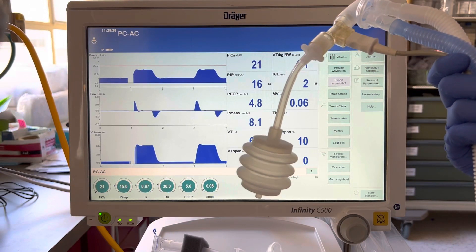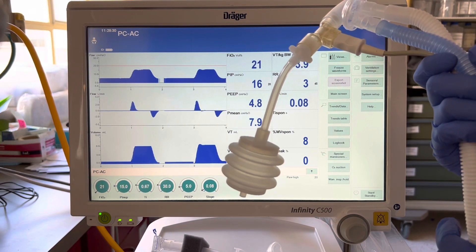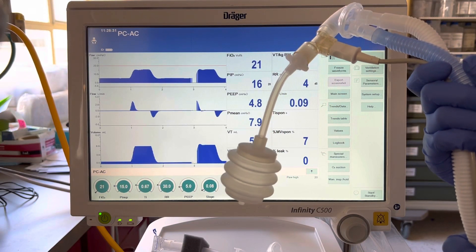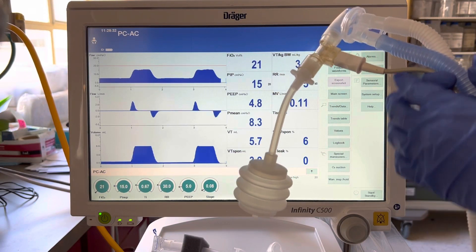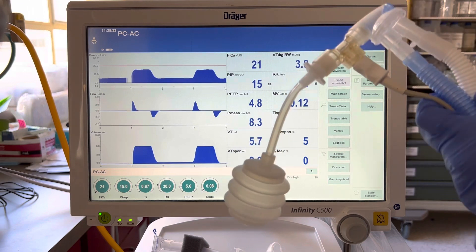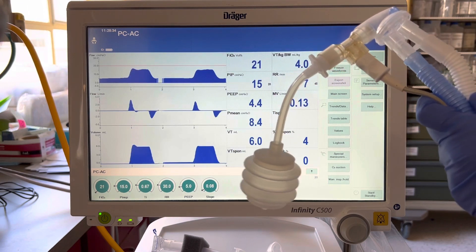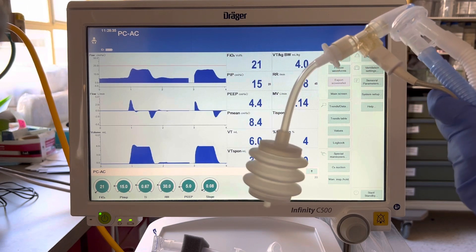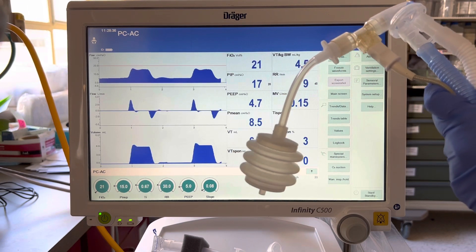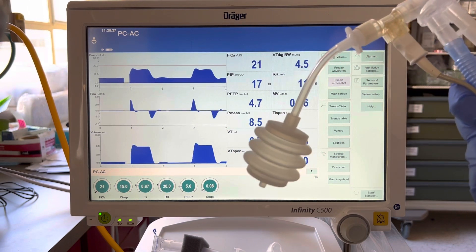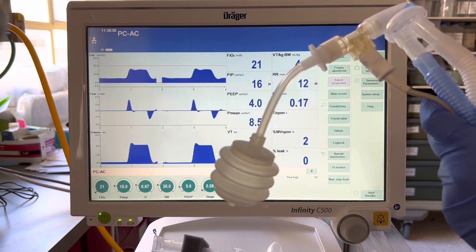I'm going to show you how to change from invasive to non-invasive CPAP mode. First, you want to have the bedside nurse or another RT to bag the baby or deliver mask CPAP during this change.